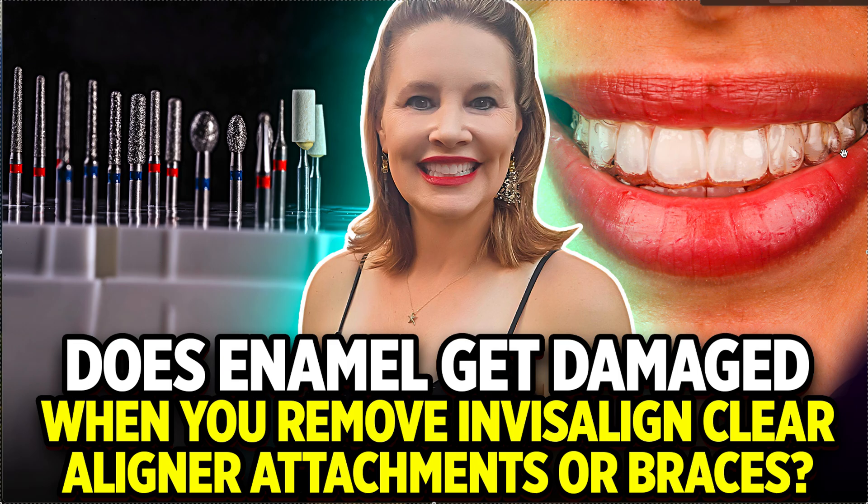Then I switch to something more fine — either a stone or a 12-fluted carbide. A carbide has stripes — little notches — rather than the bumps you see on a diamond burr. A 12-fluted carbide is very, very fine. Even if it does touch your enamel at all, it's really not cutting it significantly.